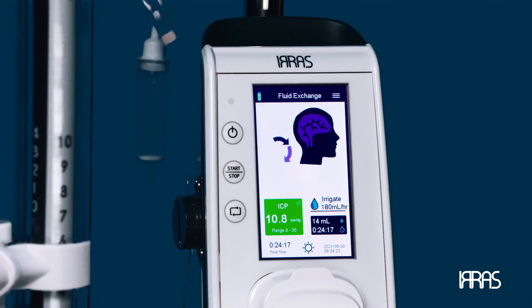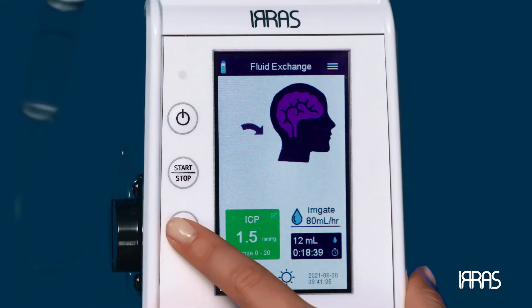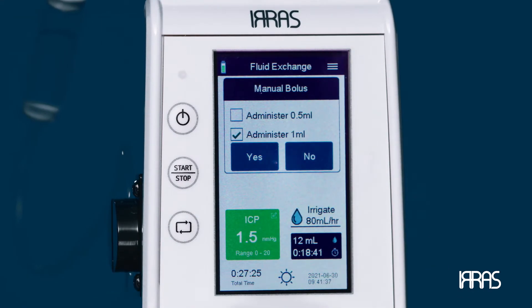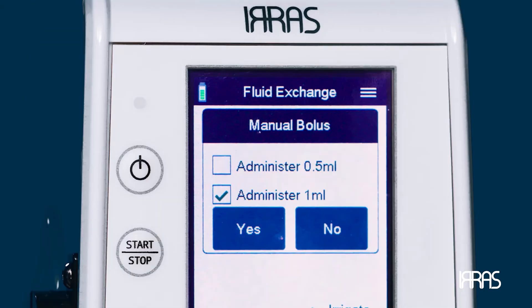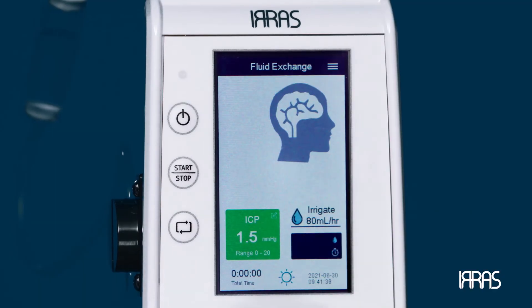Bolus — if you would like to deliver a manual bolus, you can do so in two separate ways. Press the manual bolus button on the left border of the control unit, choose between delivering a 0.5 or 1 milliliter bolus, confirm your selection, then press yes.